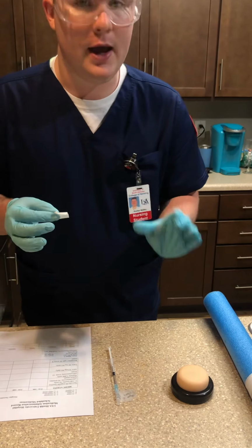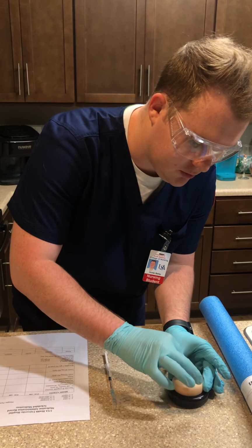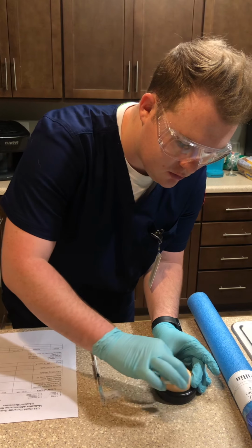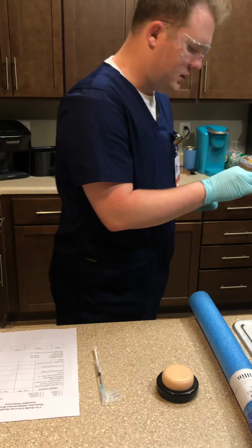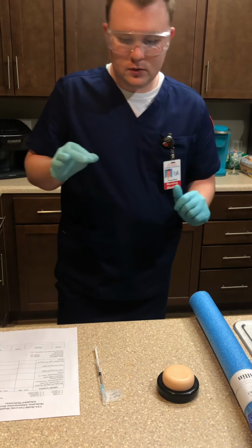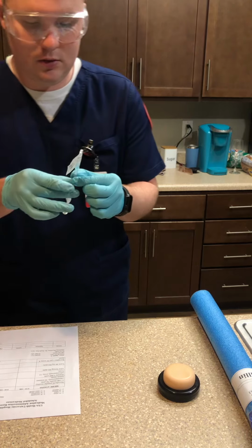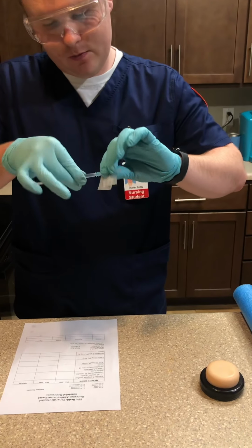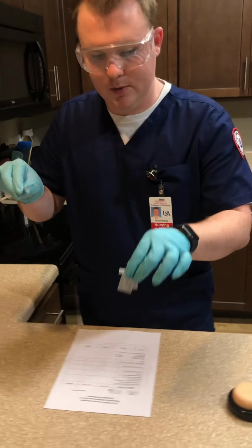Okay, and I'm going to go ahead and clean the site of injection in a circular motion. Okay, dispose of it in the trash. So now what I'm going to do is I'm going to take my medication, and I'm going to uncap it. I'm going to sit this down.